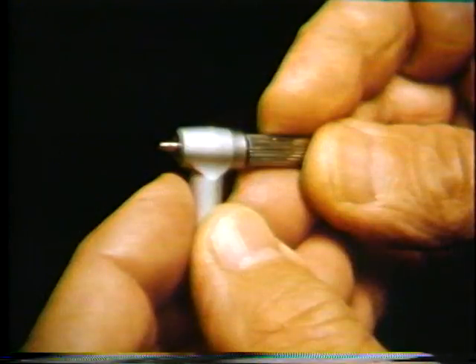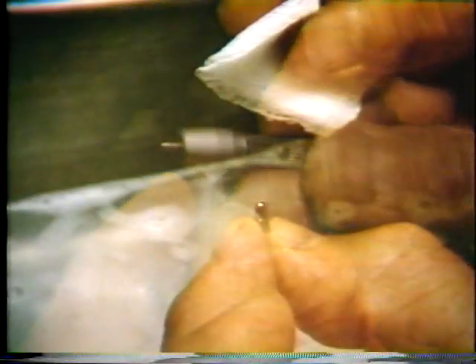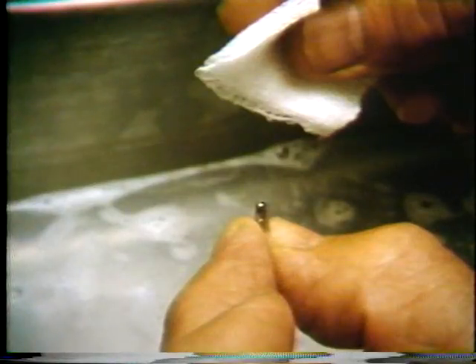Then turn the head of the contra-angle over and use the pusher tool supplied in the kit to push out the non-threaded or grip part of the chuck. Clean both parts of the chuck in hot soapy water and dip them in alcohol. A piece of paper can be used to clean out the slits in the grip part of the chuck.